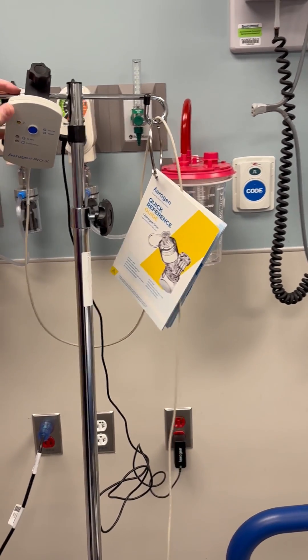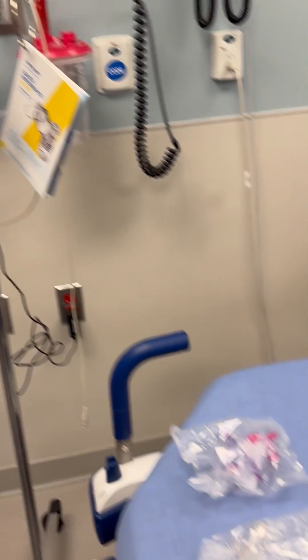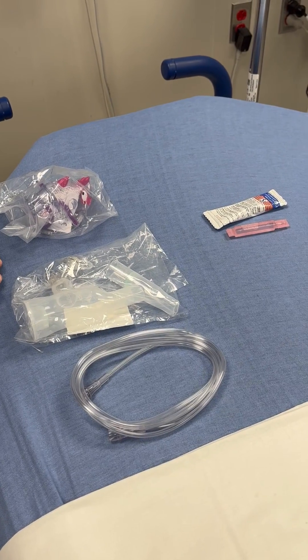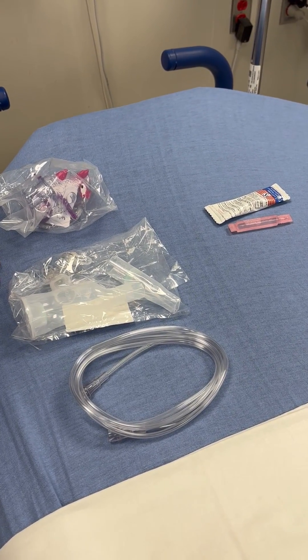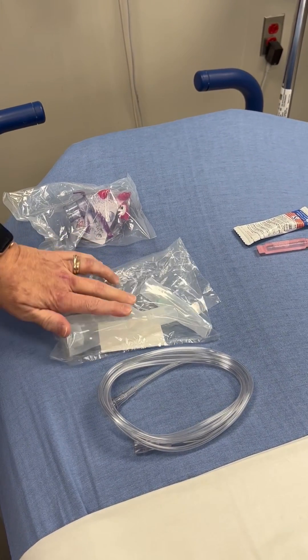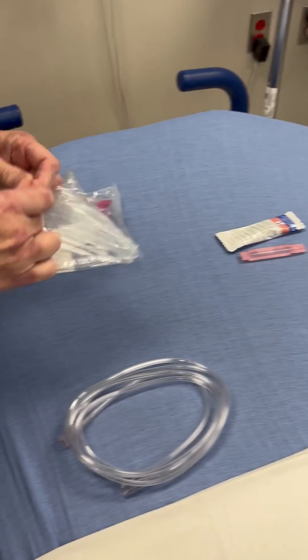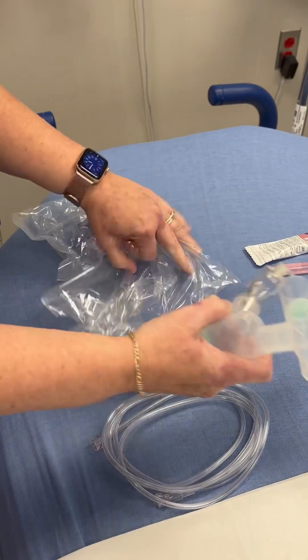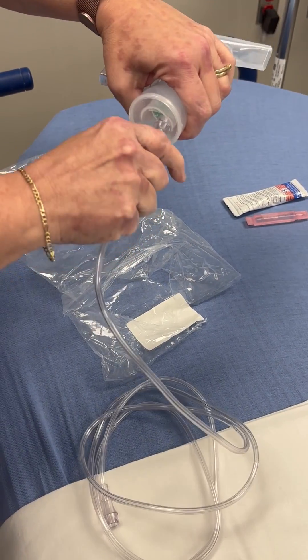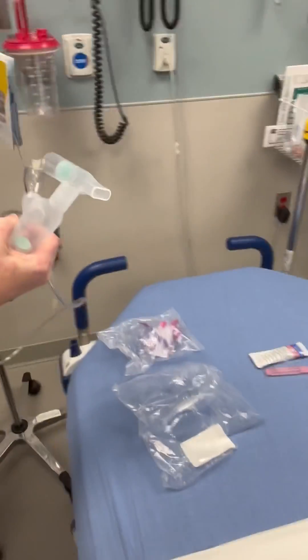The second part we're going to do is we're going to put together our nebulizer. We're going to be doing a racemic epinephrine treatment for a child that has been diagnosed with croup. So we have our pediatric mask, we have our Aerogen nebulizer with chamber, and oxygen tubing. We're just going to open this up and the tubing is going to go underneath, and then we're going to plug this into our flow meter.